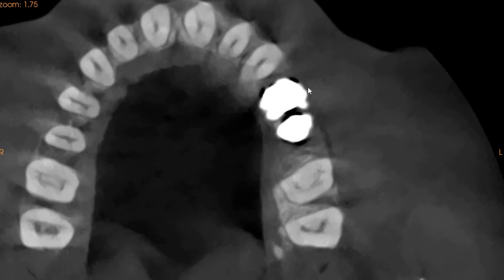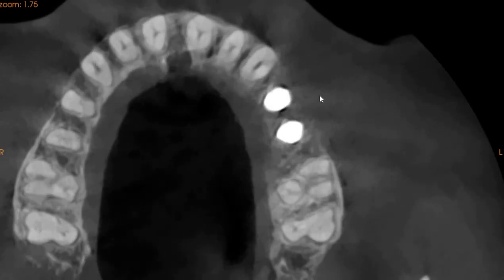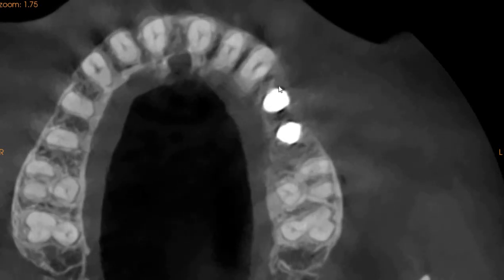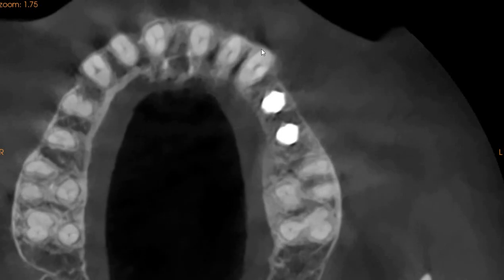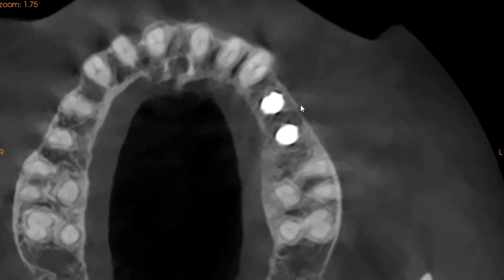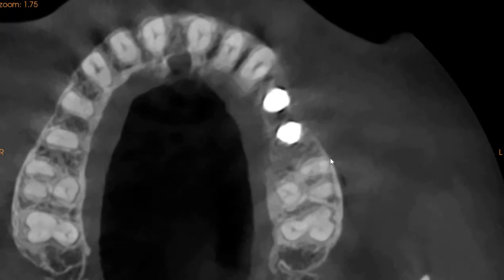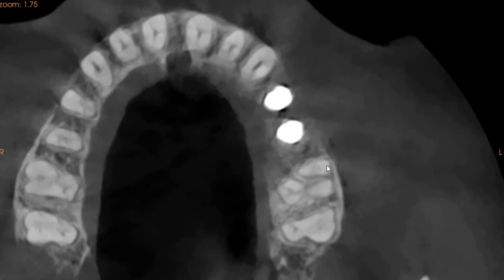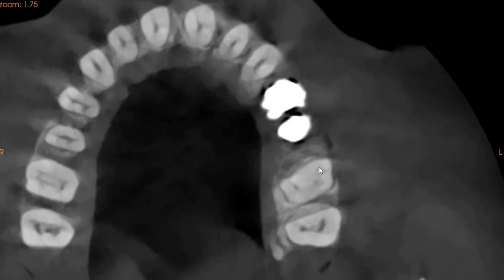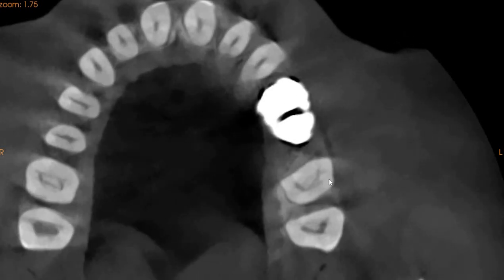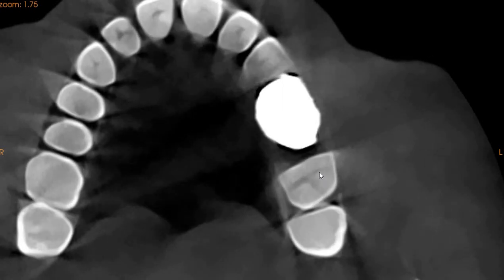Moving slightly apically, the implants are in the center. We don't see any bone loss or any problems around the implants. We do, however, see a slight lesion on the upper left first molar which is close to the pulp.